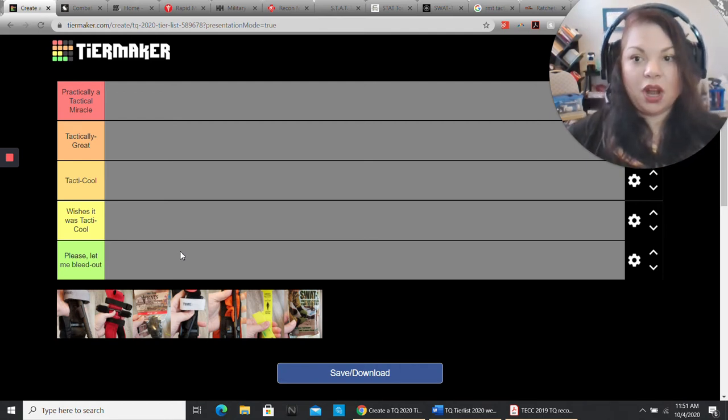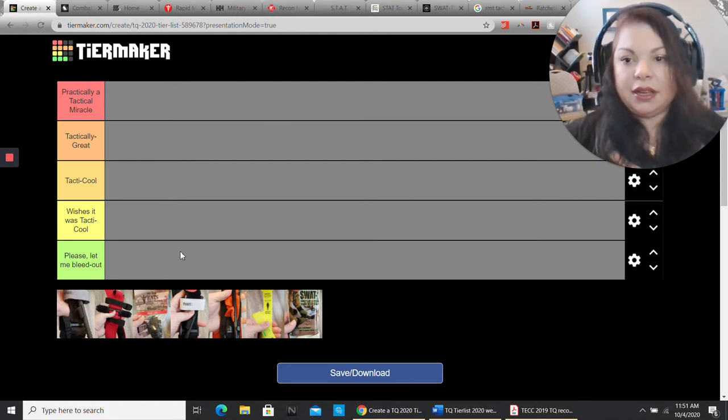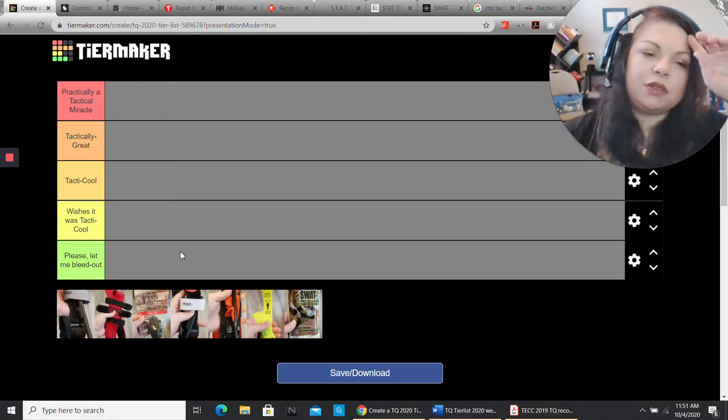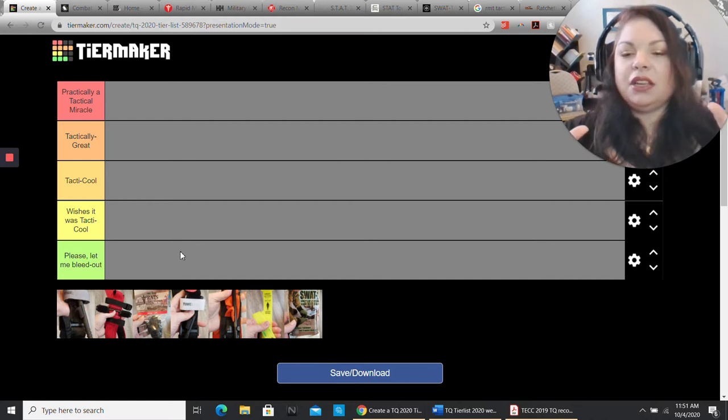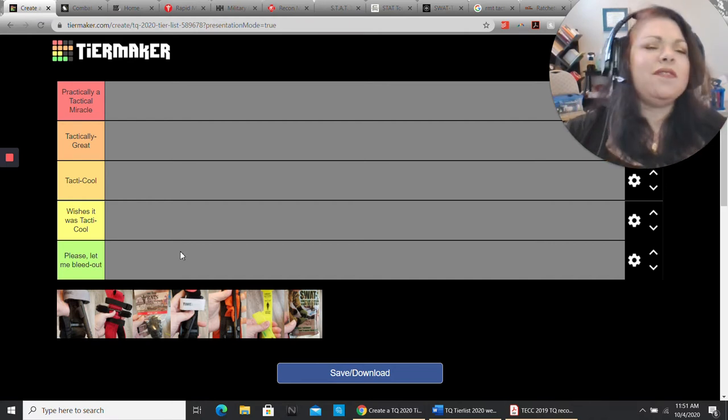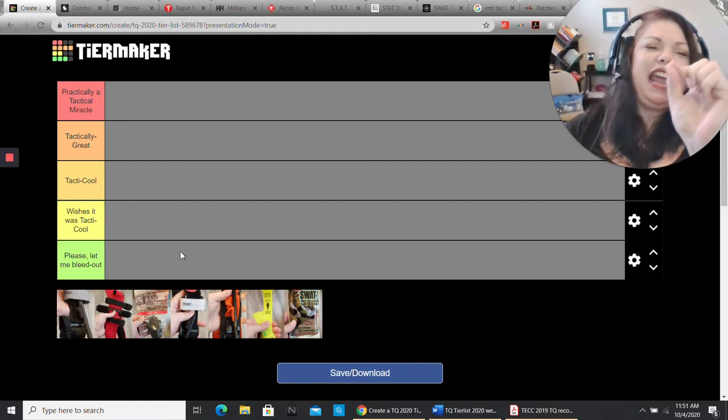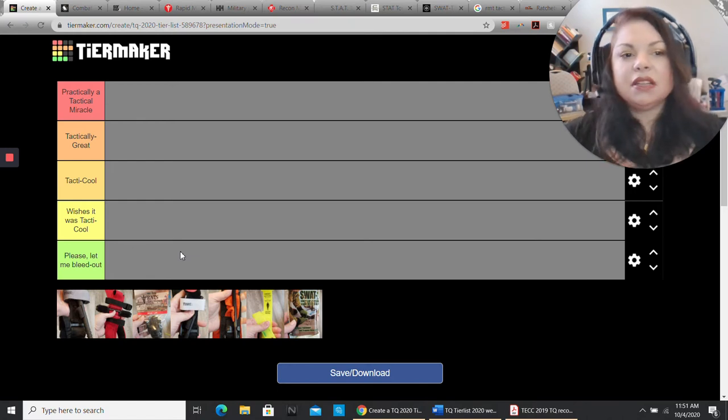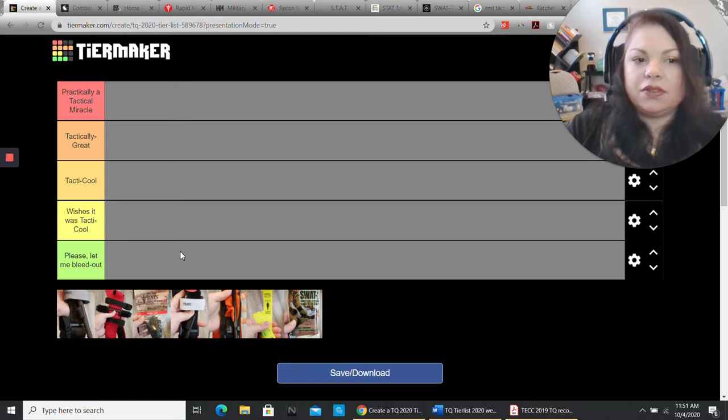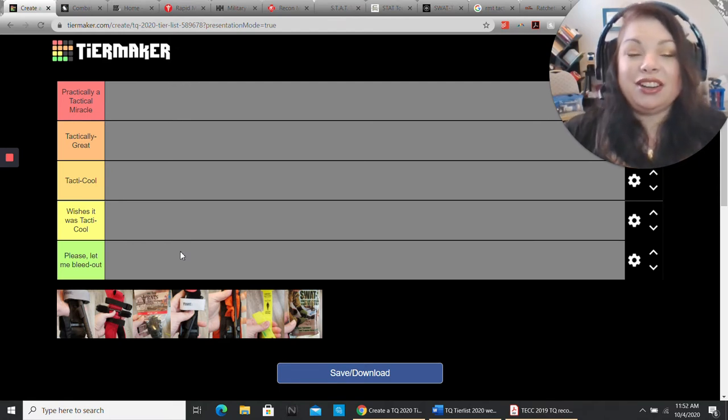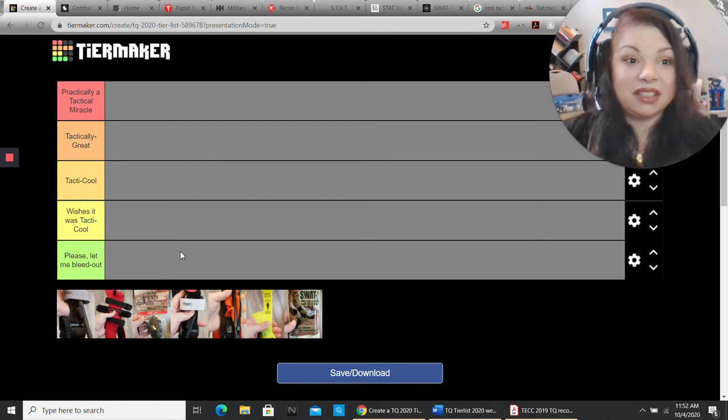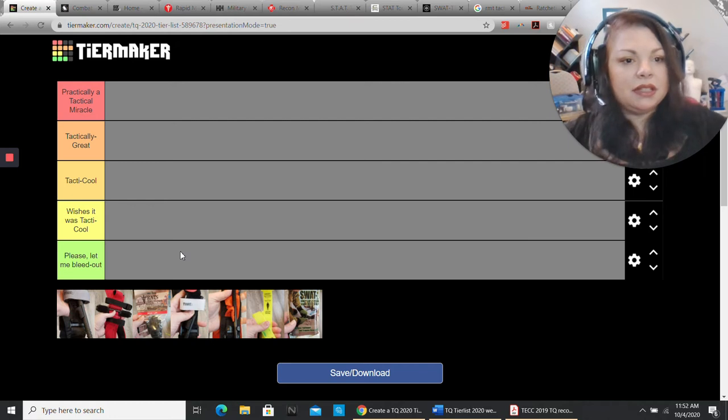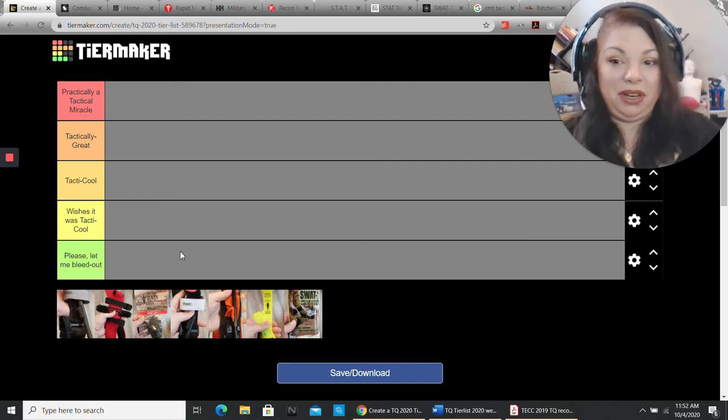So what are my tier rankings? At the absolute top, the best, the most fabulous, is something that is practically a tactical miracle. This is a tourniquet that is so wonderful it ticks, if not all the boxes, it nearly ticks all the boxes. Tactically great means that it actually does what it's supposed to do, and it does it pretty well. It ticks pretty much all the boxes.